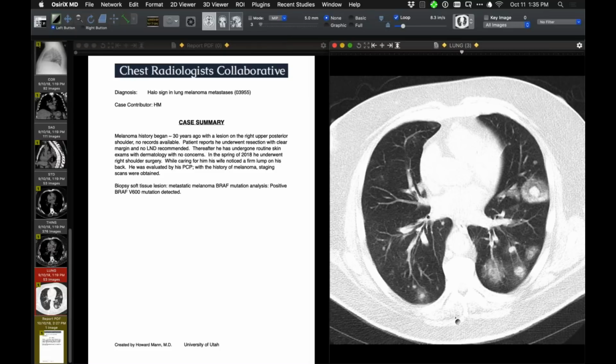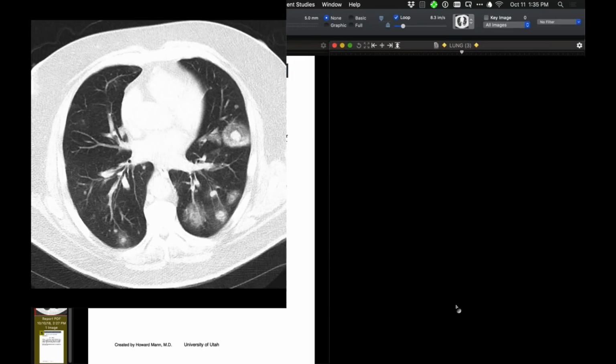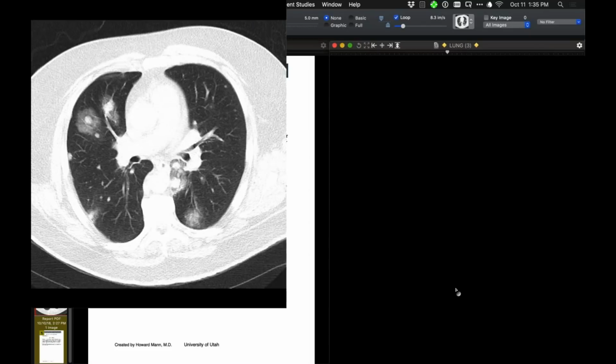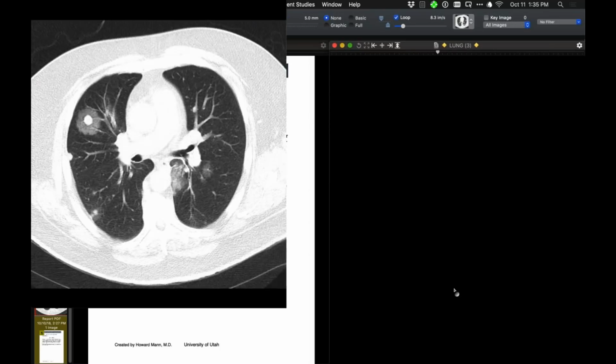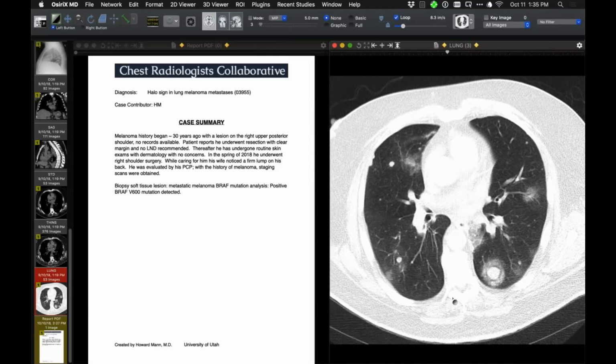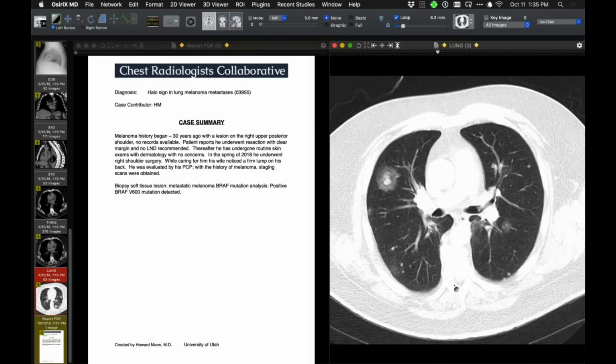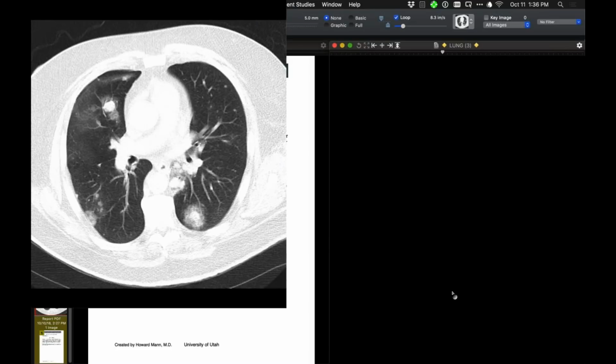And we always, I guess, ascribe the ground glass halo to hemorrhage. I don't know if that... Yeah, right. And we had this discussion here because Brett Elliker made the point. He's like, why would hemorrhage just stay around for months? You wonder what it really is. What it really is, exactly. I don't know what it is.